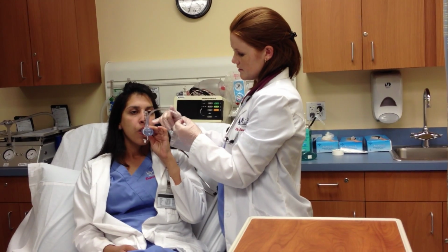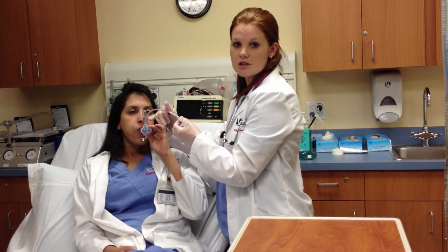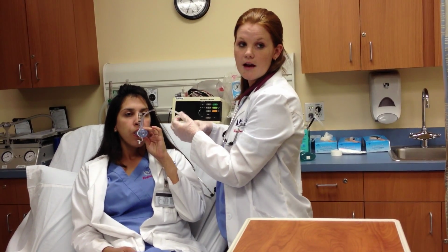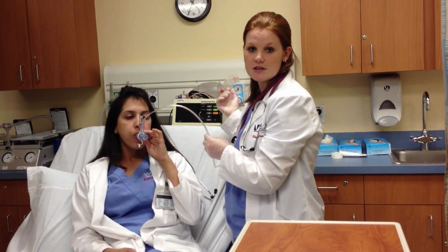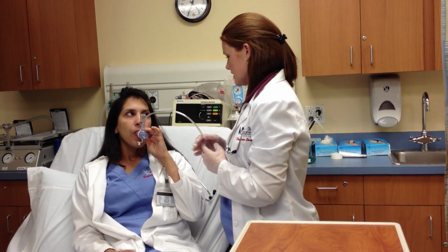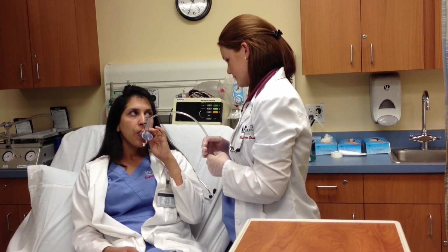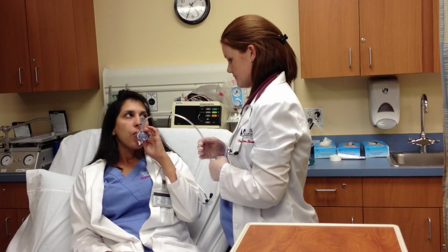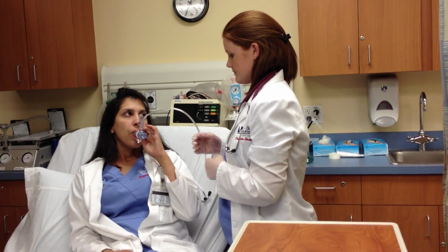While she's doing this, I'm watching the manometer pressure. Her goal is to get it between 10 to 20. I can adjust the flow if she is able to tolerate it. Now I'd like you to demonstrate 10 to 20 breaths for me. Okay.